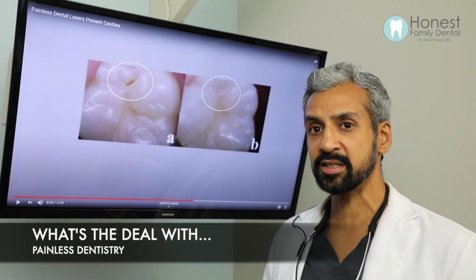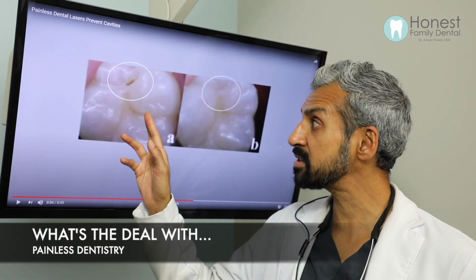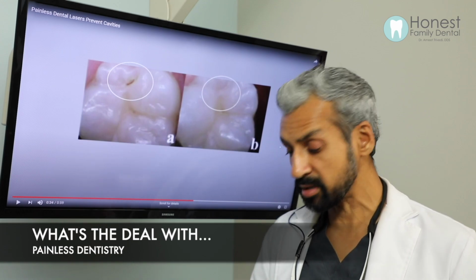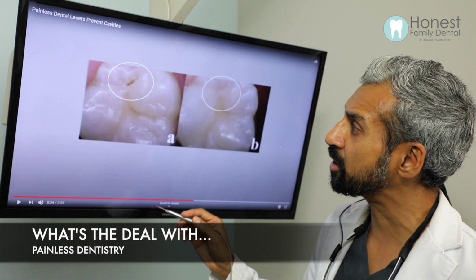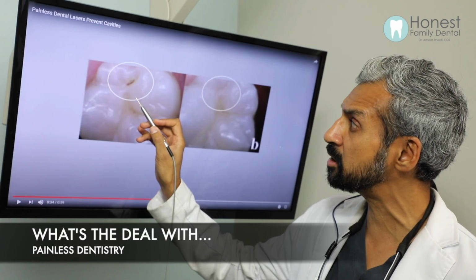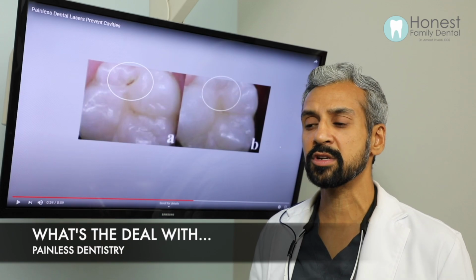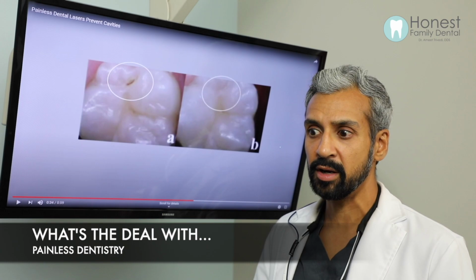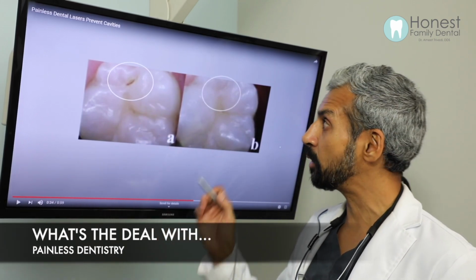So if I can utilize technology that makes it so I don't have to do a filling, but I still treat this decay, that's amazing. And that again is using laser technology. I take my laser, you're not numb at all, and I wave it over this area for probably about 30 seconds. It vaporizes just the decayed part of the tooth, not the enamel. Once I do that, it might be small enough that I don't even have to put a filling in there. I can just use what's called remineralizing paste, because tooth decay is a demineralization of the enamel, and that's how bacteria got in. So if I remove the bacteria, I remineralize the tooth, and we get it to a healthy state.